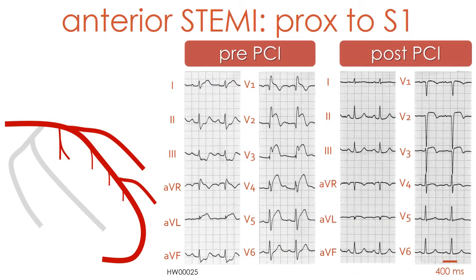This electrocardiogram shows another very important sign of proximal LAD occlusion: the development of peri-infarction right bundle branch block as a sign of occlusion before the takeoff level of the first septal branch.